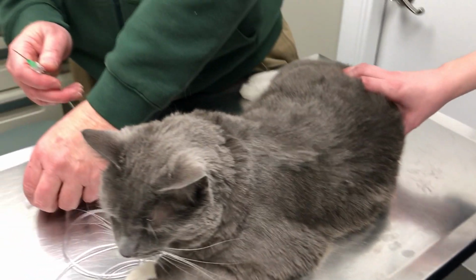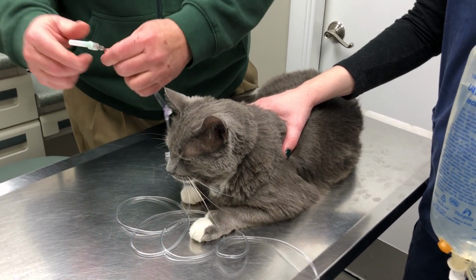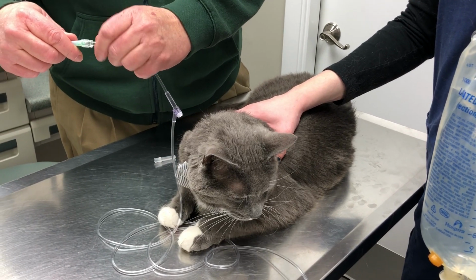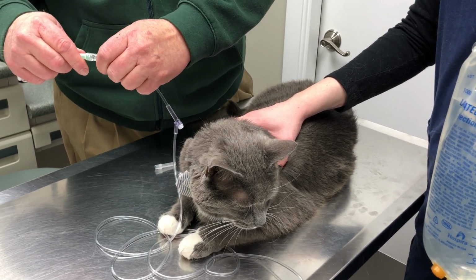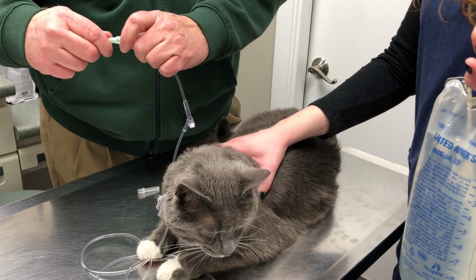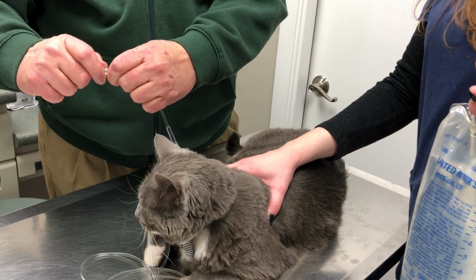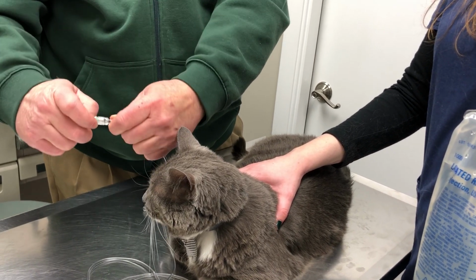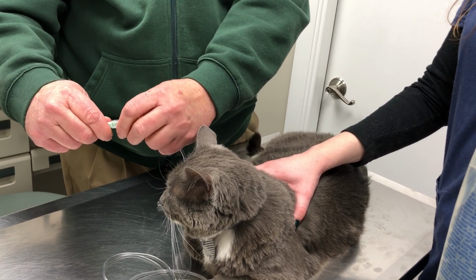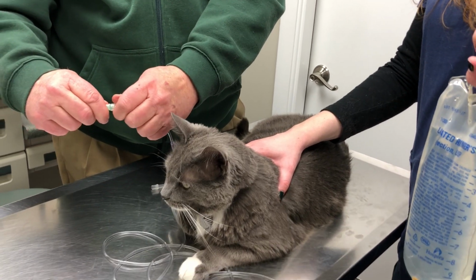And then we're going to put the syringe cap back on the needle so that it can be safely removed. A lot of times we'll leave these on for future use, but getting these on and off can be a challenge at times. So again, if you just spin that top like that, it spins on and it spins off. And that's how you're going to take it on and off.